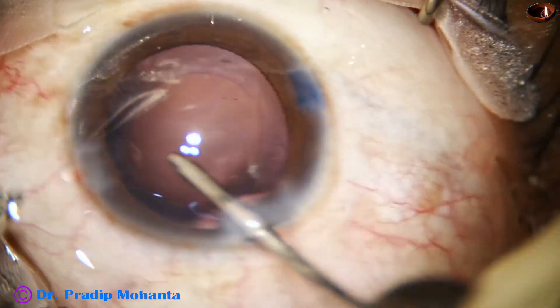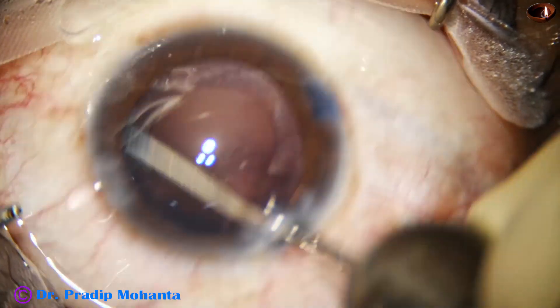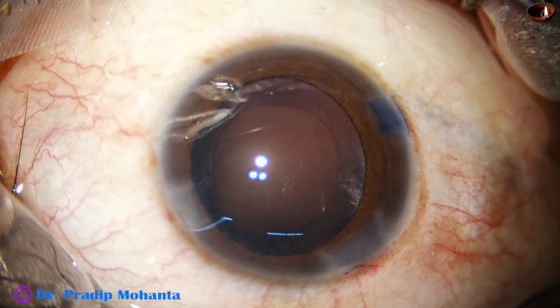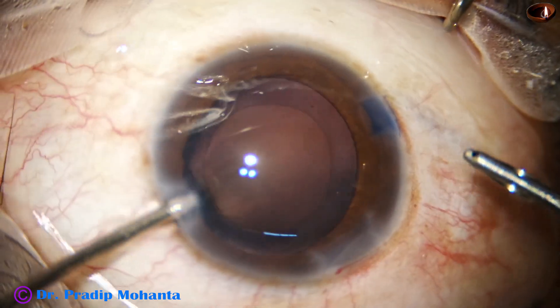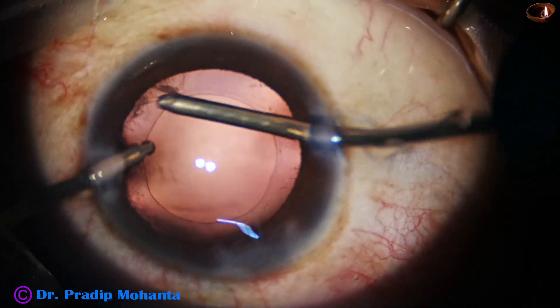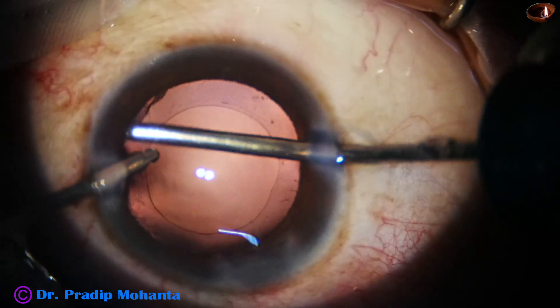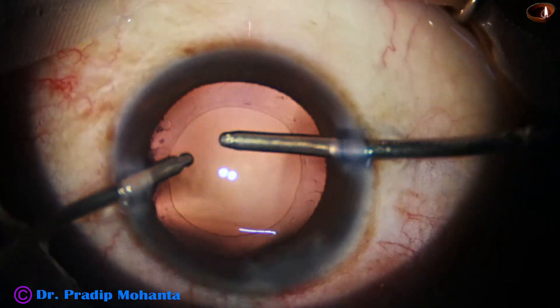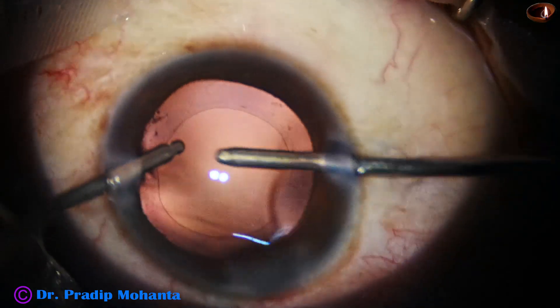In this case I have not used Simcoe for cleaning of the cortex. You should practice all instruments and be competent in using all instruments used in cataract surgery. Don't say 'I use only bimanual' or 'I use only Simcoe' — you should learn to use all instruments, as in some cases Simcoe will be easier and in some cases you will need bimanual.